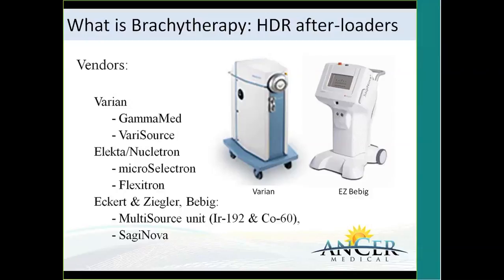One thing I'd like to say about that, Ken, is I would be hard-pressed to imagine you're ever going to encounter that in a U.S. center. Right, sure. The iridium 192 is the standard in the U.S. If a center was using cobalt, it would really be a matter of how it impacted their treatment planning, and would have very little effect on yours and my end of things. Okay. All right. Perfect. Thank you very much. Yeah, yep. I don't think it would affect treatment planning that much either. It's really just about the resources in the clinic.